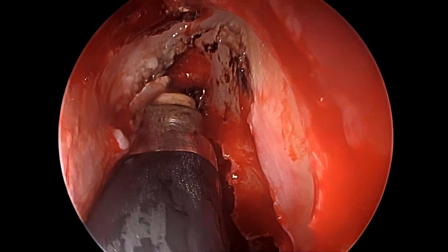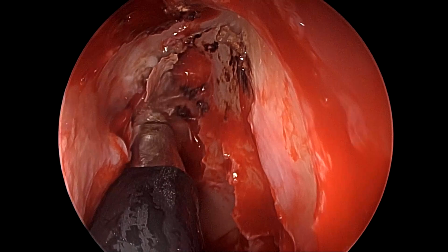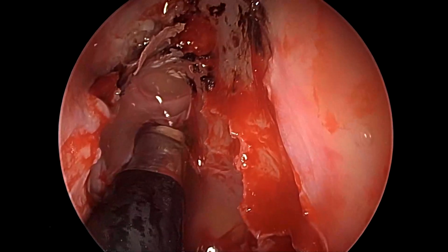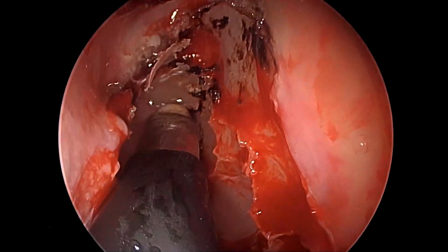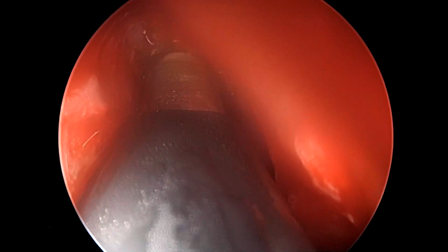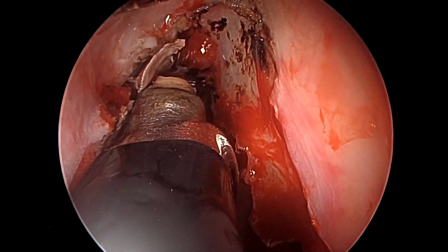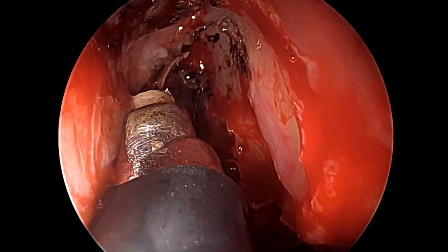In fact, also the mucosa on the lamina papyracea towards the superior aspect, as well as the superior aspect of the lateral middle turbinate mucosa. So all in all, this is very safe here, because unlike a shaver, which can sometimes protrude and penetrate the skull base, the coagulator does not penetrate the bone, and hence even while working on the skull base, it's an excellent tool because it offers control, as well as this slight bend of the tip, which comes in very handy in making contact with the angled skull base, even with the 0-degree endoscope.